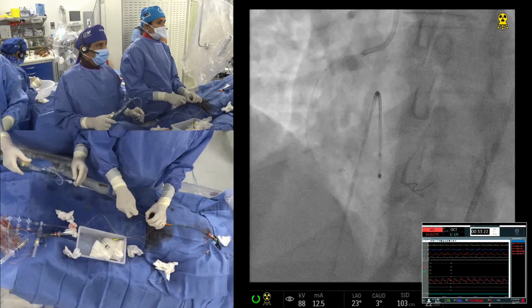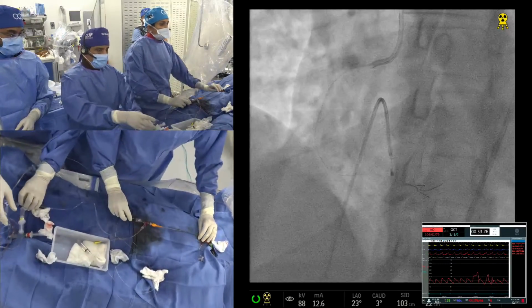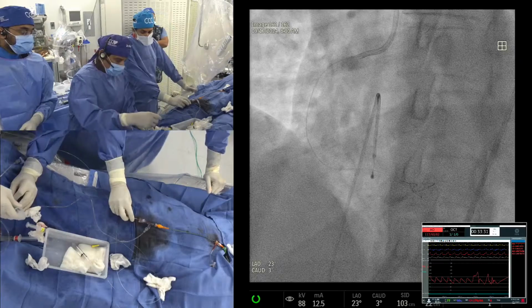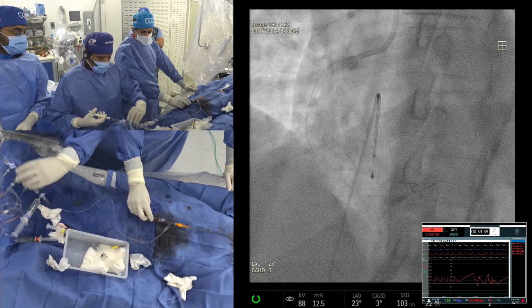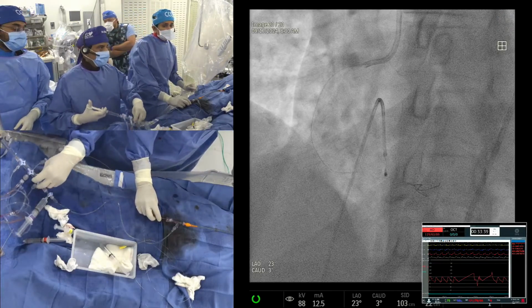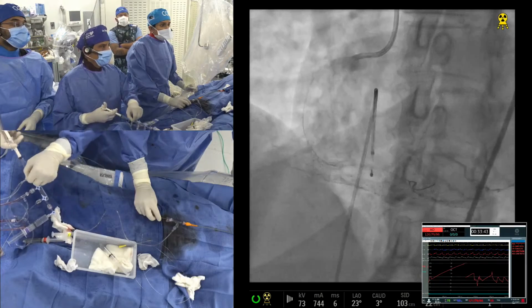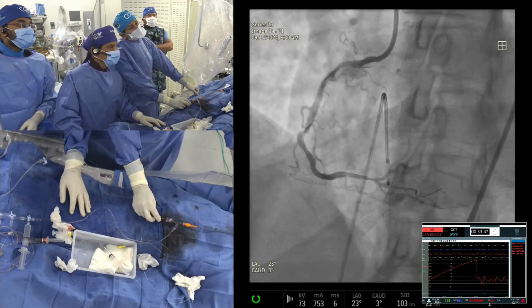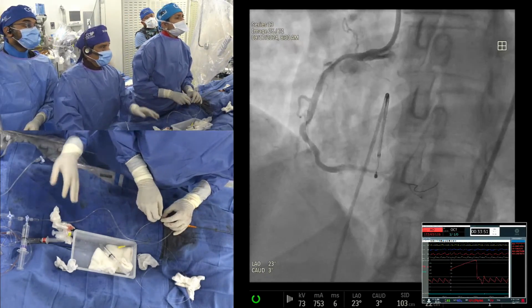And I did the experiment back in 1998. Let's give vasodilators now. The question is that by low speed, maybe you're doing more of an orbital situation. But I think you'll have more distal embolization, more chances of burr entrapment, wire bias, or all sorts of perforation issues. That's always there.